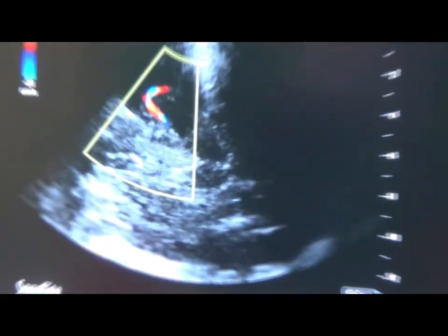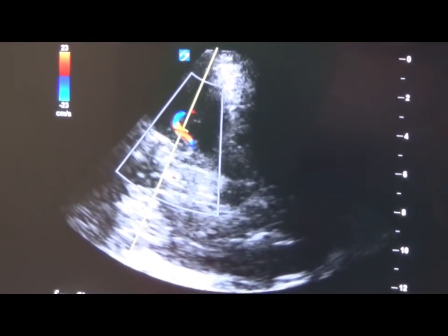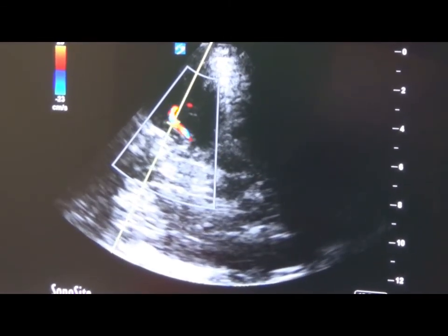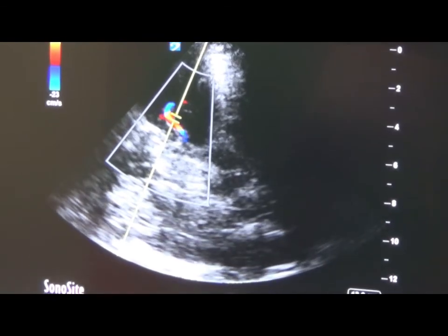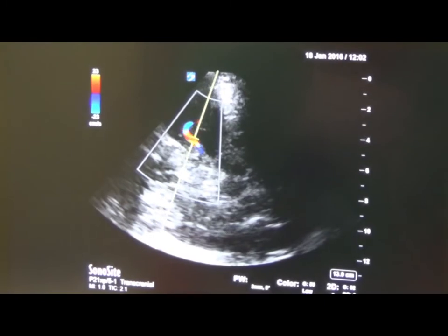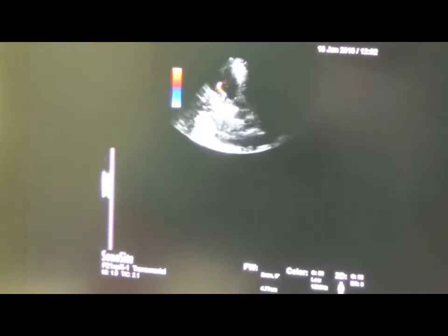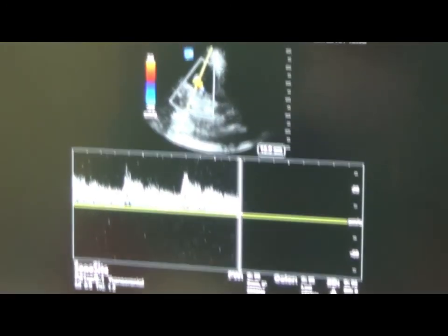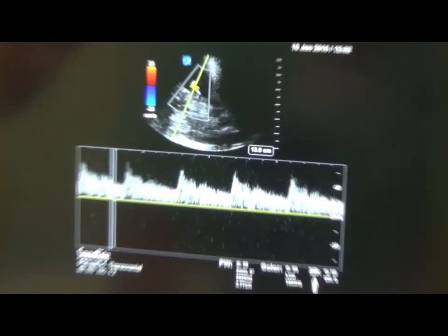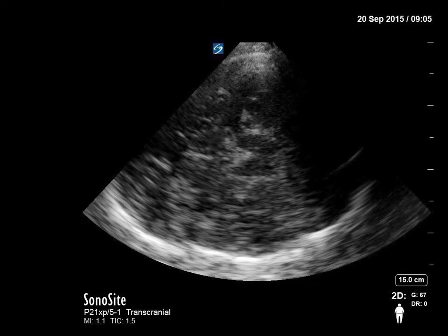snake-like structure, which happens to be the middle cerebral artery, and I'll put Doppler over there and take a Doppler scan anywhere between the segments. Once there is a pulsating segment, you have to take a Doppler recording. Then you press start, then you get the blood flow. Once the blood flow is obtained, you have to freeze it and do the various calculations.